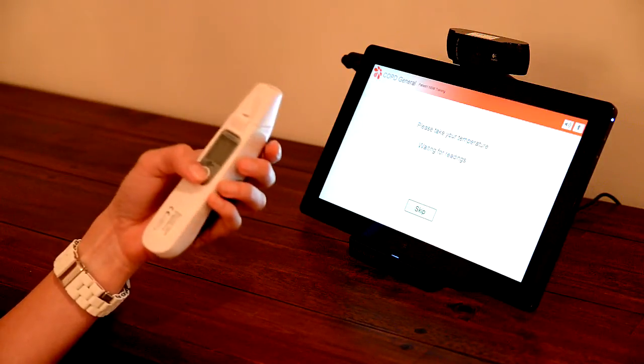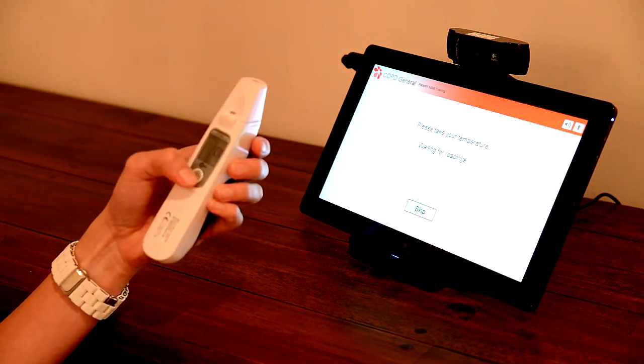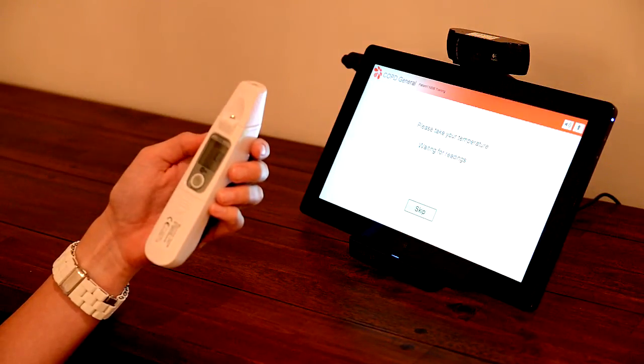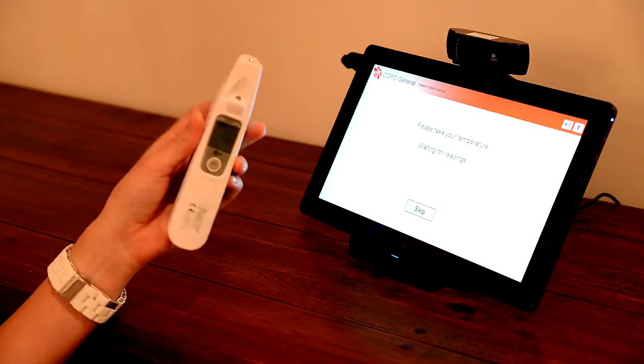To take your skin temperature, first ensure the large white cover is fitted to the probe. Then press the ON button near the display window and wait for the display to show the previous measurement.